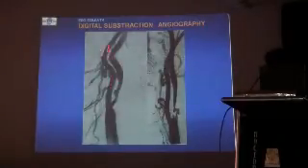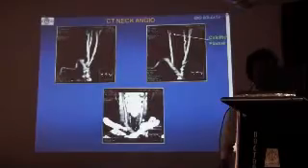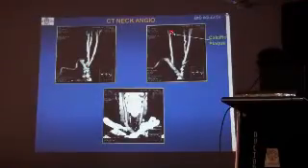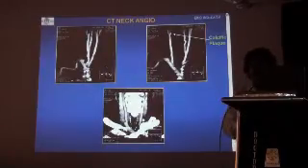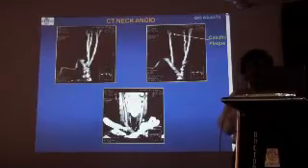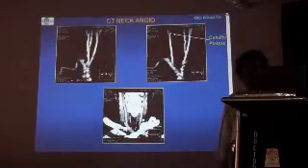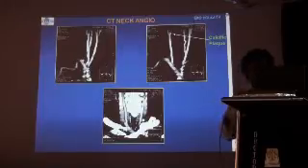Now we had digital subtraction angiography for the neck vessels to show you narrowing. Or CT angio of the neck vessels is possible, but CT angio is very important in one sense: it tells you whether you are dealing with a calcific plaque or a soft plaque. A soft plaque is more vulnerable to detachment and may lead to cerebral stroke. So CT can differentiate soft plaque and calcium. And there is a calcium scoring system, especially in coronary CT.